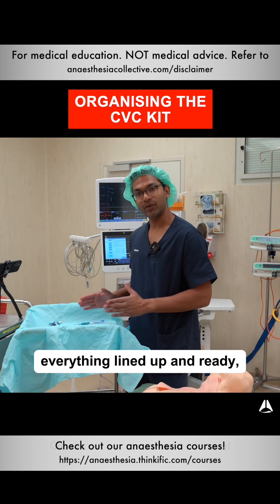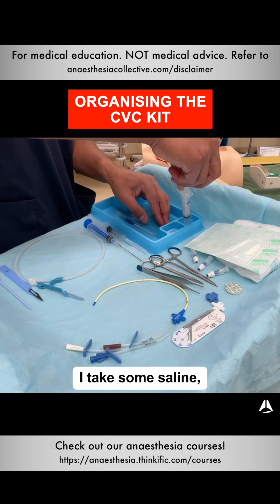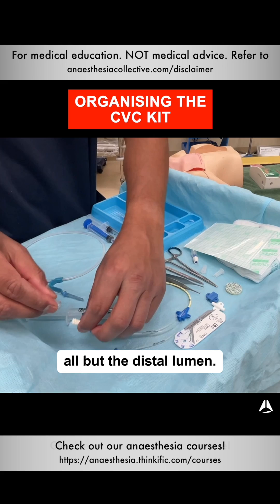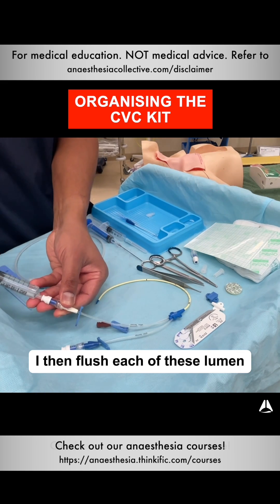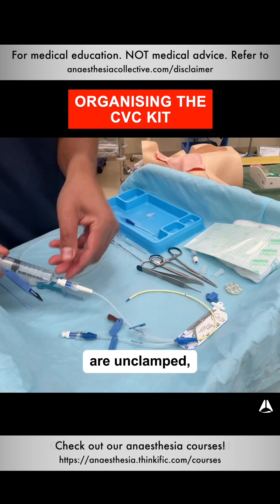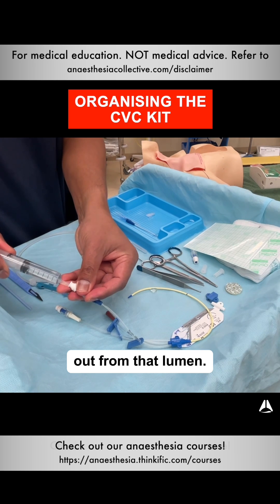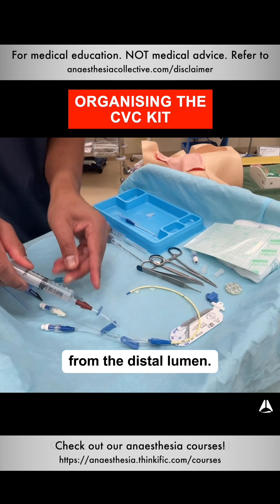Now that I've got everything lined up and ready, the next thing I do is prep my CVC line. I take some saline, then cap all but the distal lumen — I don't cap the distal lumen because that's where the wire is going to feed. I then flush each of the lumens with saline, making sure that the clamps are unclamped and that they're patent. You'll see saline coming out from that lumen, then that lumen, and finally from the distal lumen.